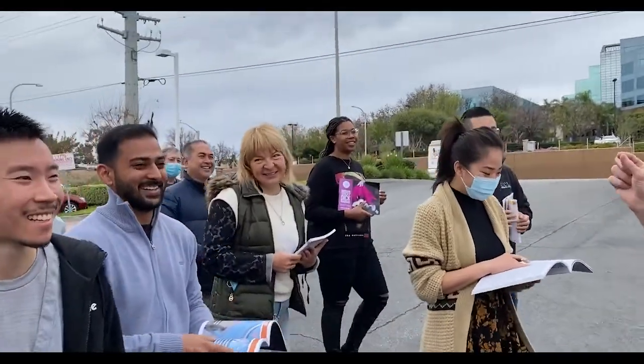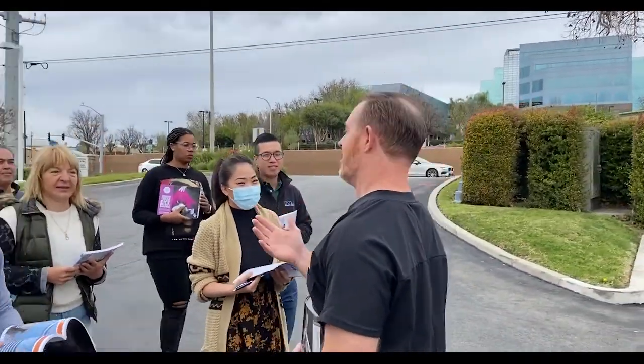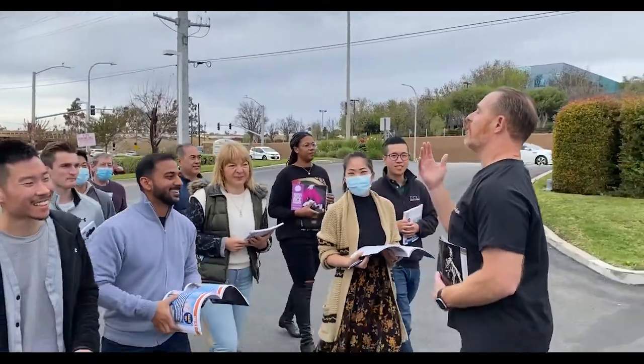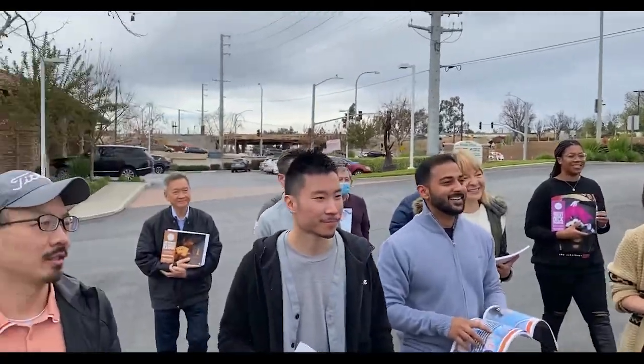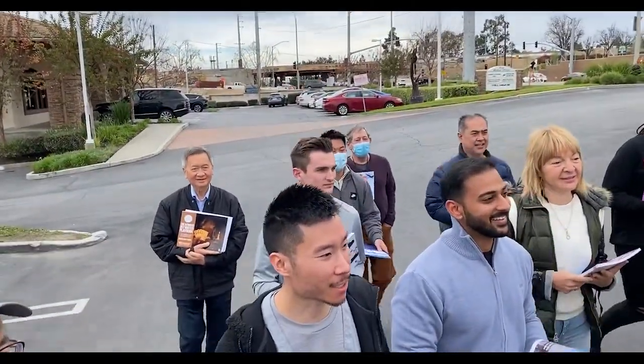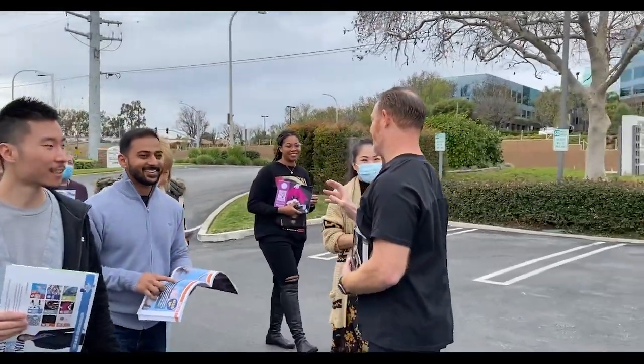We negotiated patency, we forgot to get what? Get our working length with what? With the apex location. Then what? And we get that 10 file. Then a loose 10K file, loose at the apex. Then what? Then we shape.